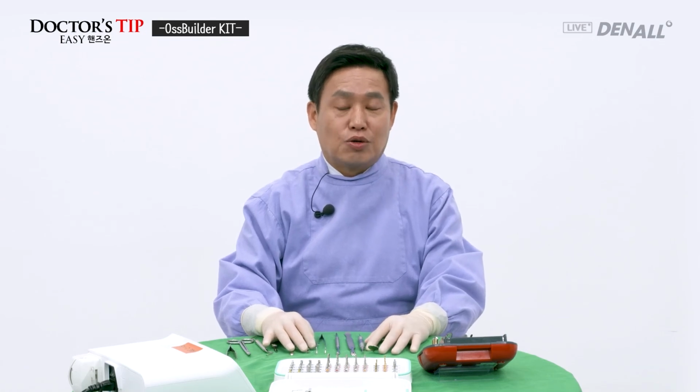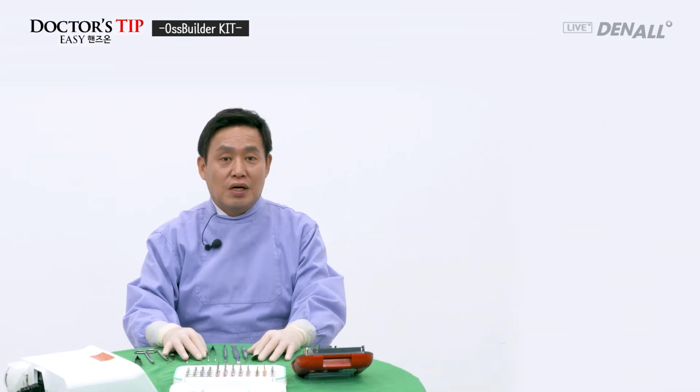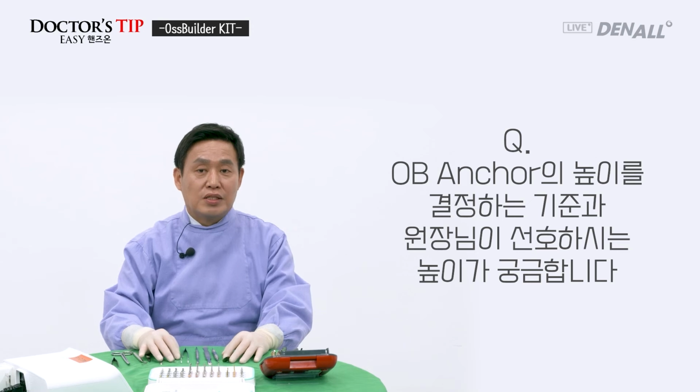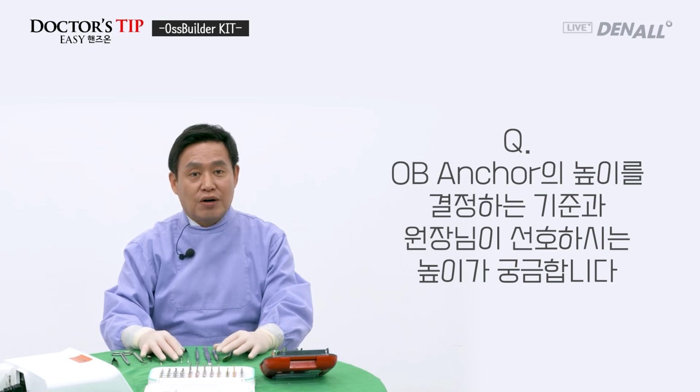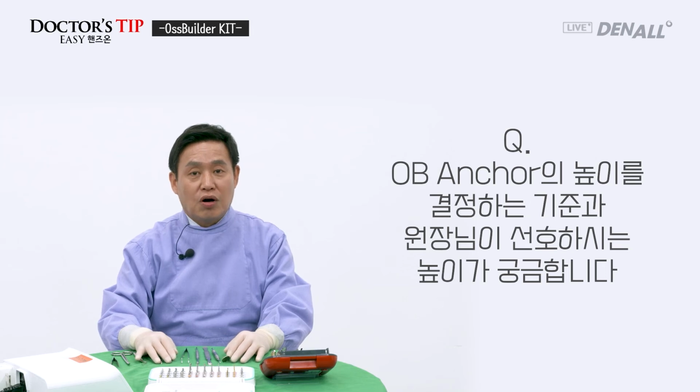Up until now, we did hands-on practice on OssBuilder KIT, and I'm going to look at some questions. The first question is the criteria for choosing height of OB anchor and the height that I prefer. I mentioned this earlier, but in the case of OB anchor, for TS3 type, the height ranges from 0 to 3 millimeters, and it increases by 0.5.